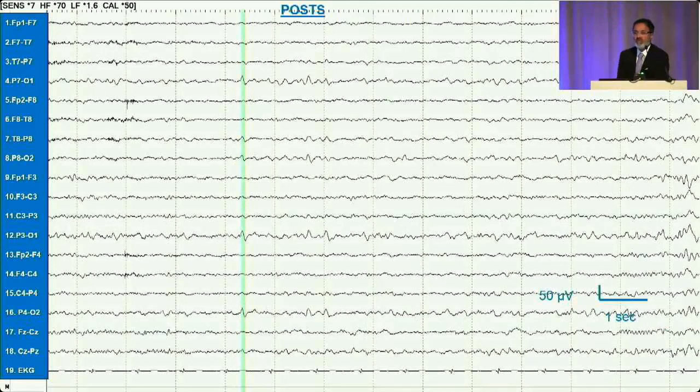Positive occipital sharp transients of sleep, or POSTS, are findings seen in stage 1 sleep. These are positive transients that are seen in the occiput, and they can also be seen in runs. You can see them here. They're seen symmetrically, both in the left and the right occipital regions, and they can be seen in stage 1 and stage 2 sleep, but less commonly in slow wave sleep.